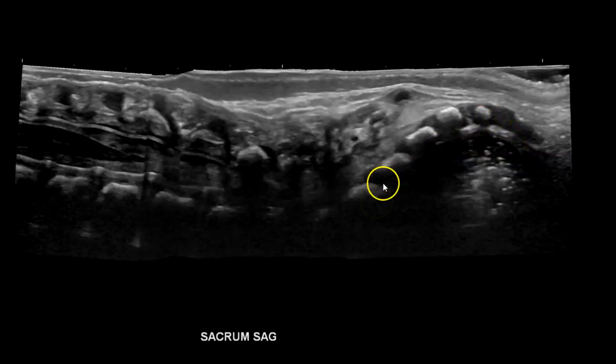Then I try to get the lumbosacral region. I already attempted a panoramic view — you can see it's not great, with some artifacts — but I'll go from the sacrum and scan up.